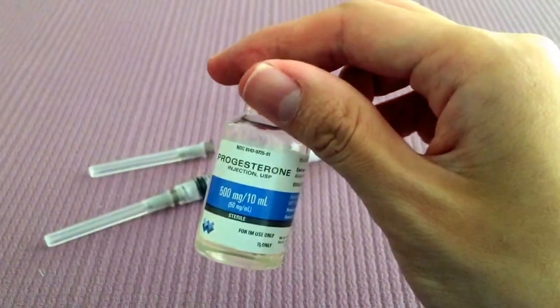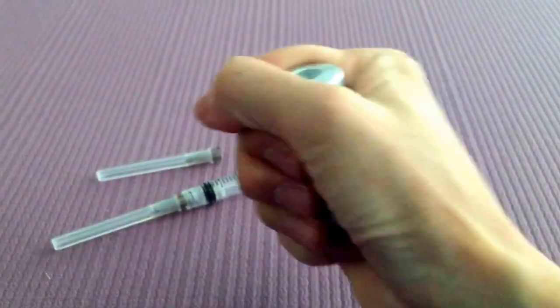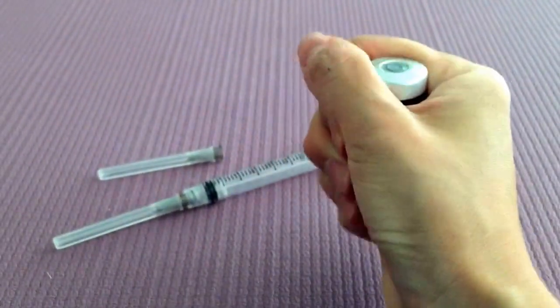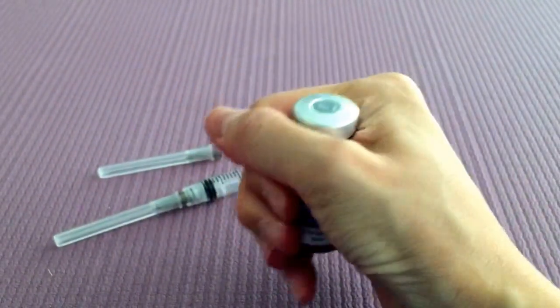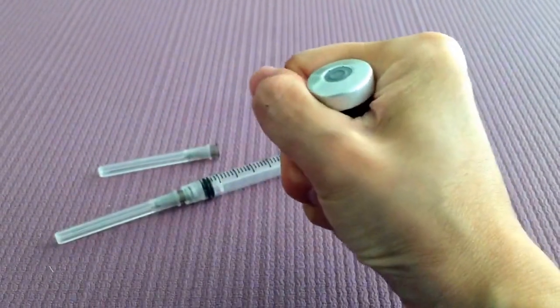So one tip before we draw this up, I like to warm it up in my hands for about two minutes. This helps thin out the oil a bit and makes drawing it up a lot easier.